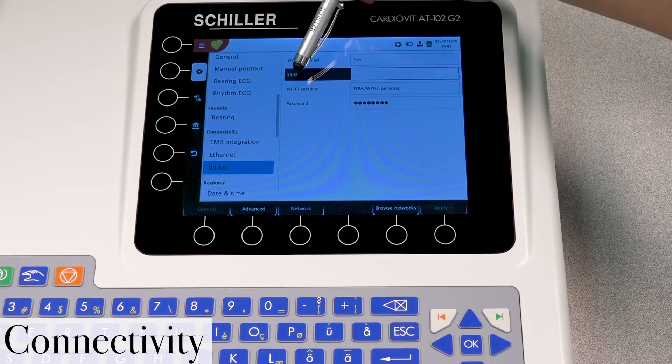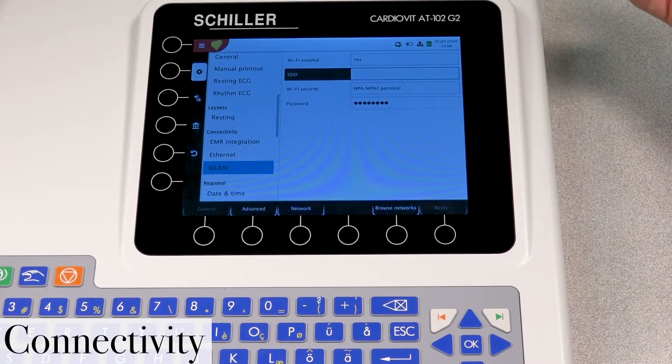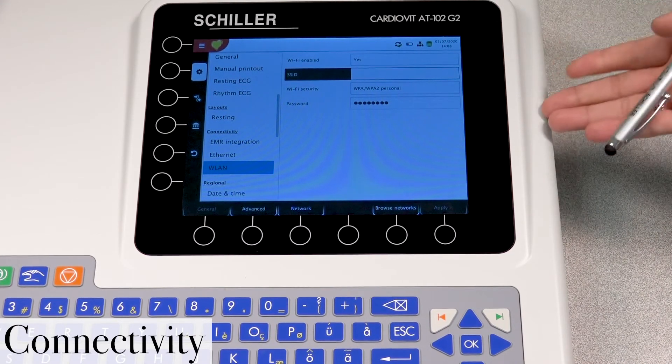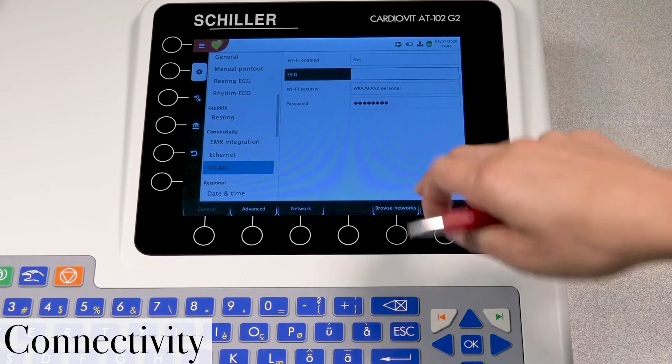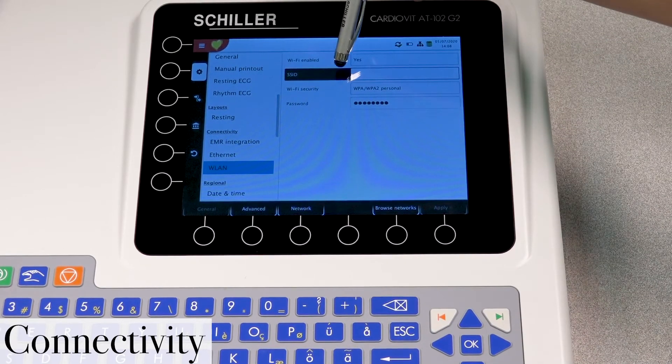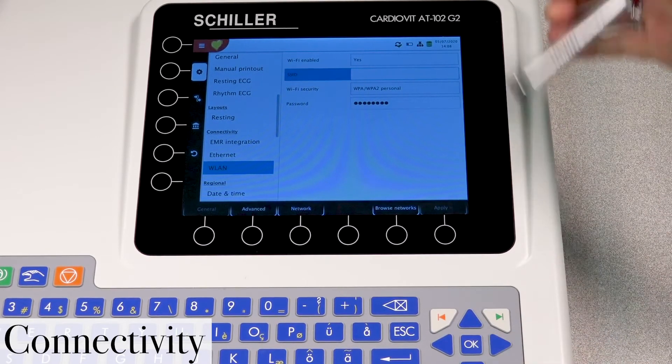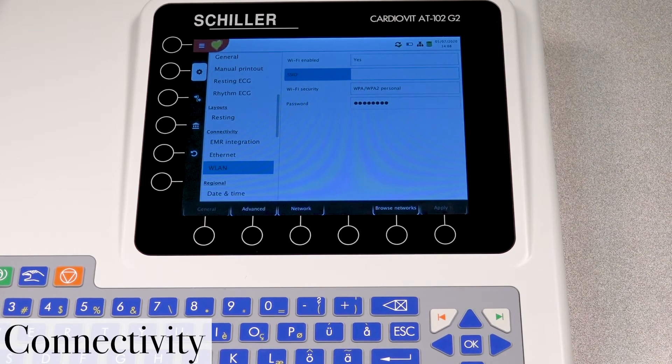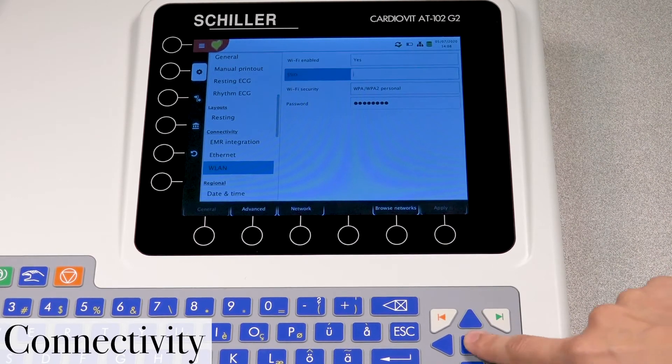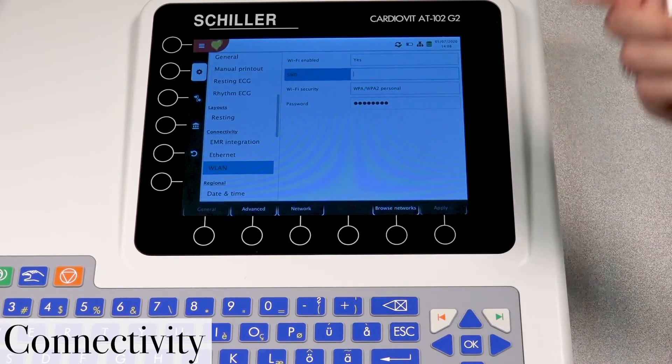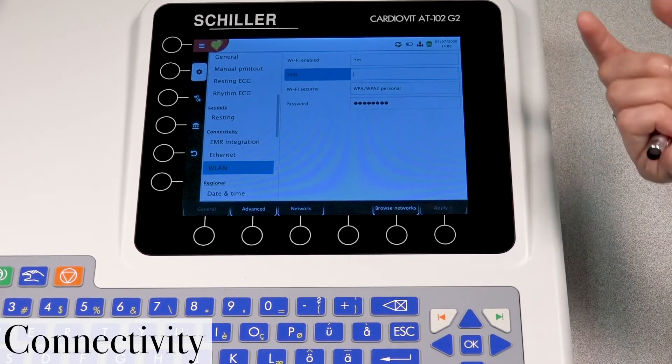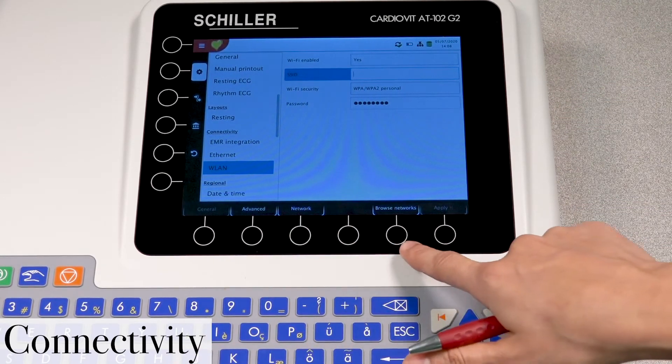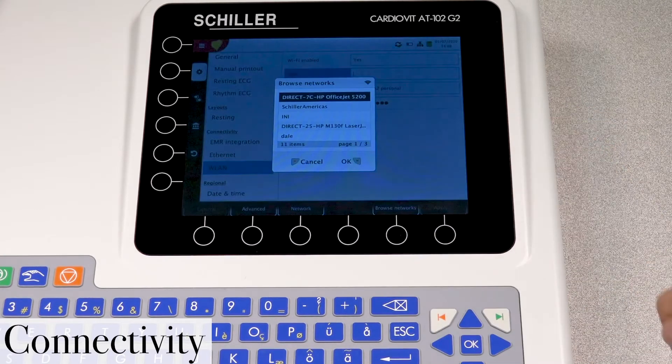Now the SSID here, this is where we will select the Wi-Fi network that we choose to connect to. So once again, you have it highlighted in black. Let's press OK to highlight it in blue. And now we can select the networks. Now in order to browse the networks, you have here toward the bottom, browse networks. We're going to go ahead and press that.